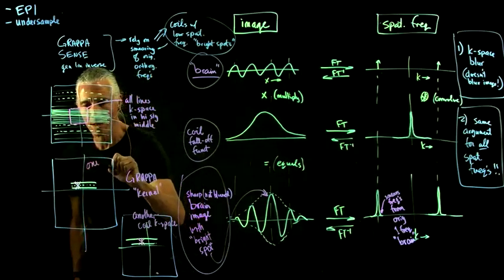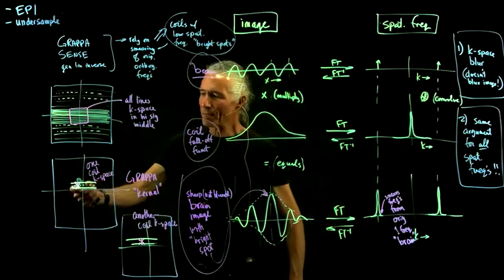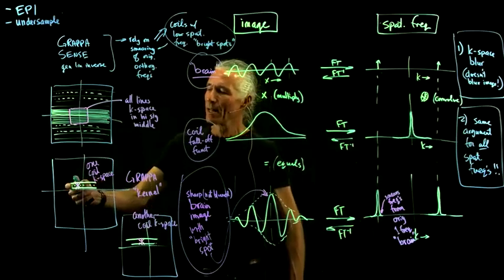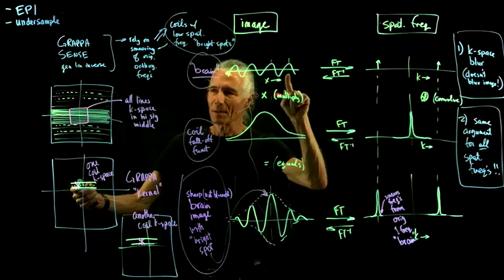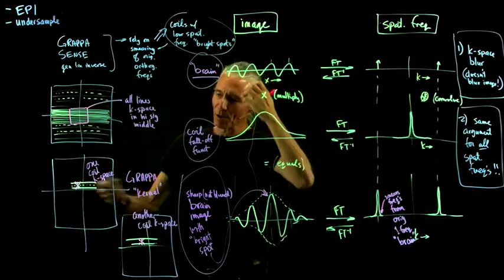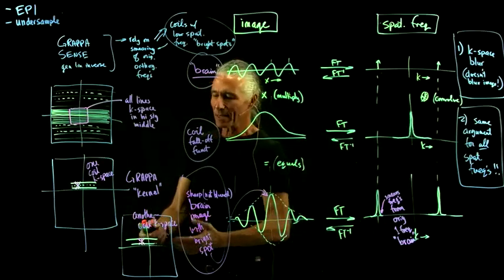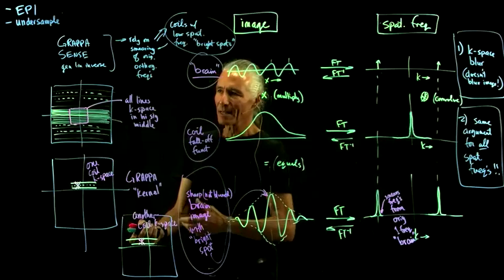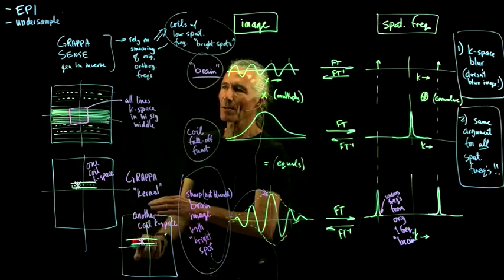This is one coil K-space, because the coils are on at the same time, and so we're getting a full K-space for every coil. And so not only do you have the surrounding lines, which have some information from every spatial frequency in them, but you also have multiple coils. And so basically what you can do is intelligently interpolate what the missing data should be on the basis of the surrounding lines, which normally would be completely orthogonal.